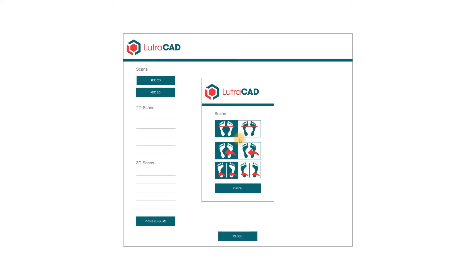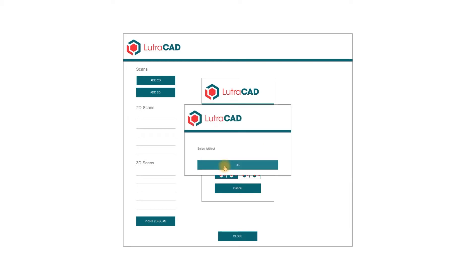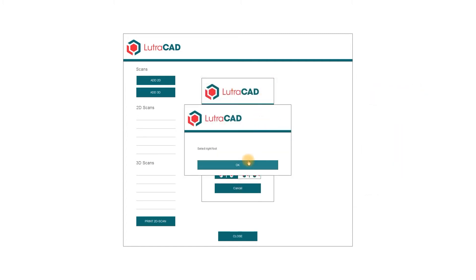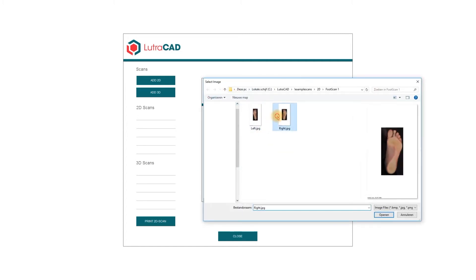The top two buttons will get their image directly from a scanner. The middle two are for adding one image of both feet. The bottom two buttons are for adding separate images per foot. For now, we add some example scans of a pair of feet that are in separate images. These images can be found on the C Drive, LutraCAD, Example Scans.